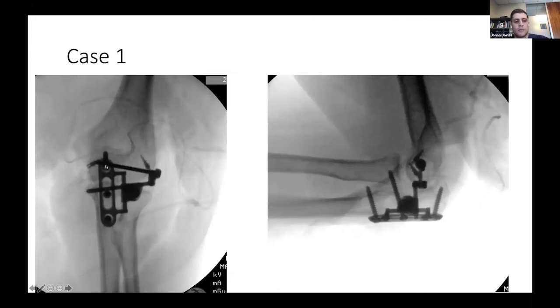And then what I do is I'll put the plate on the ulna, and prior to connecting all of those together, I'll finish the ligament repair. So you can see here I use some suture anchors, laid down the repair back exactly where I wanted the ligaments, and tied them there, secured them. Then I ranged the elbow, and it was actually pretty stable just with the reconstruction. That being said, because of that extension defect in the back of the capitellum, I decided to put the brace on, or the internal joint stabilizer.